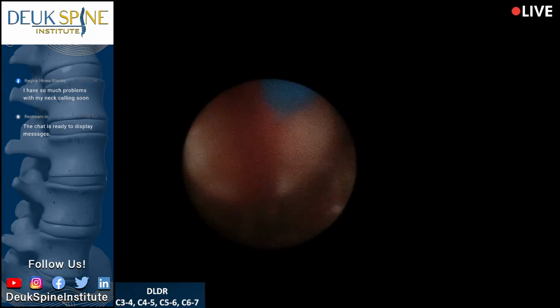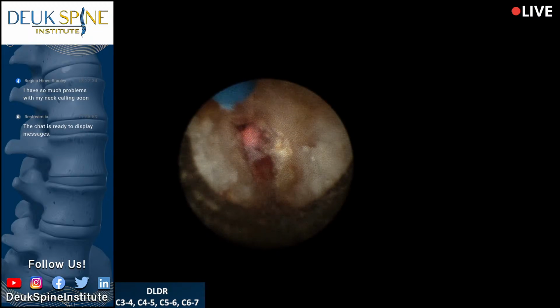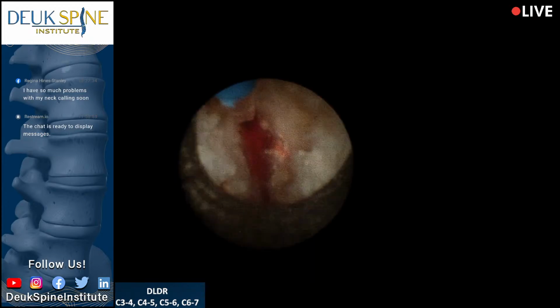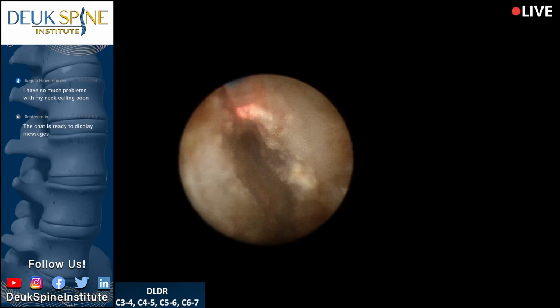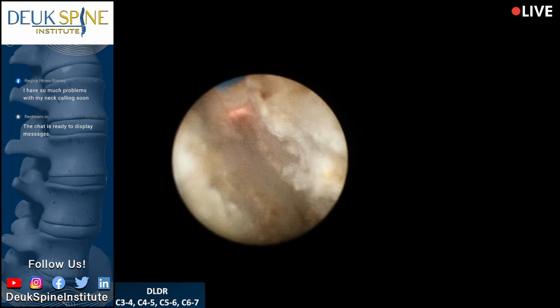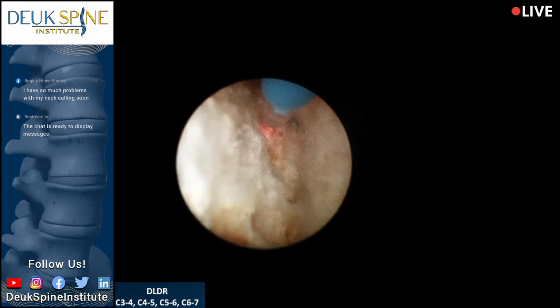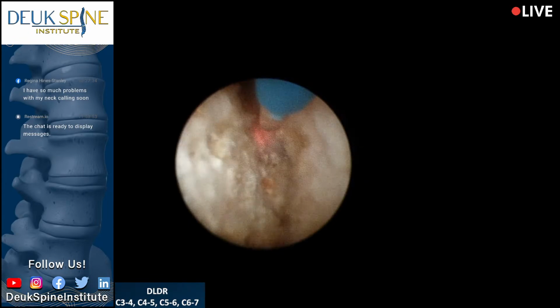Irrigation good, guys? Looks like we're out. There's another herniation going up and out. A little bit of bleeding from the bone spurs. Can't do surgery without some degree of bleeding. Fortunately, this surgery is minimal. All right, you can see how rocky this is. This is totally abnormal. It's like his discs are trying to fuse themselves.